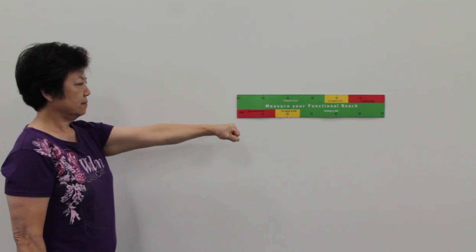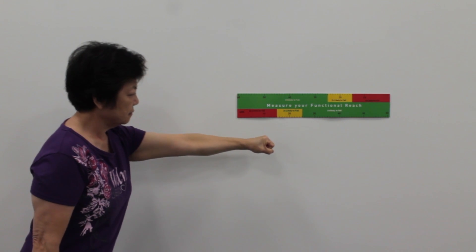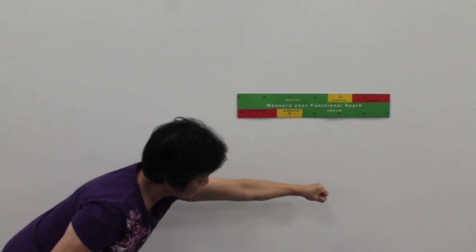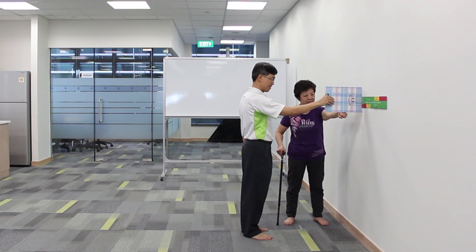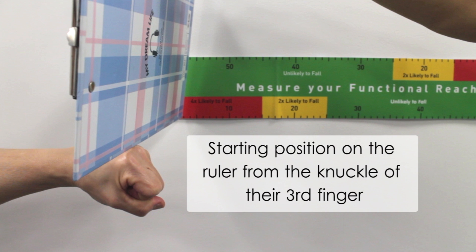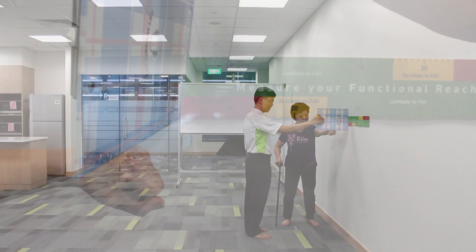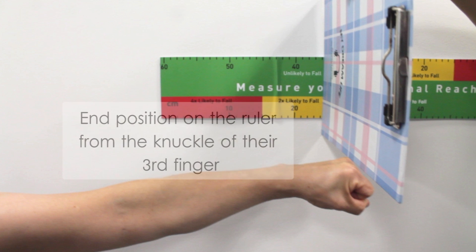Once the participant is ready, instruct them to reach forward as far as they can with their fist, without taking a step. To get the accurate measurement, first measure the participant's starting position on the ruler from the knuckle of their third finger. Once the participant is stable after reaching forward, measure the end position on the ruler from the knuckle of the third finger.